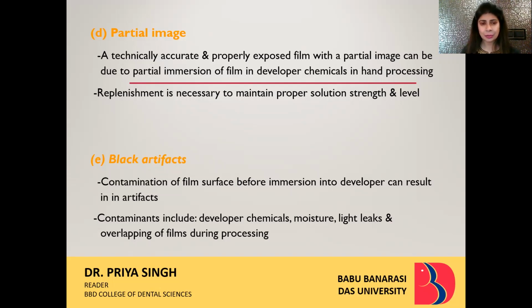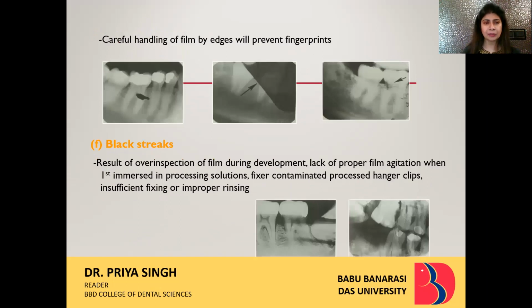So even that should be taken care of, that before opening the film, your fingers, your hands should be completely clean, and the holder with which you are going to hold your IOPA film should also be without any solution. Otherwise, beforehand only, it will lead to contamination and black artifacts. Contamination might include developer chemical before actually putting it in the processing solution, moisture, light leaks, and overlapping of film during processing. So all these will lead to black artifacts.